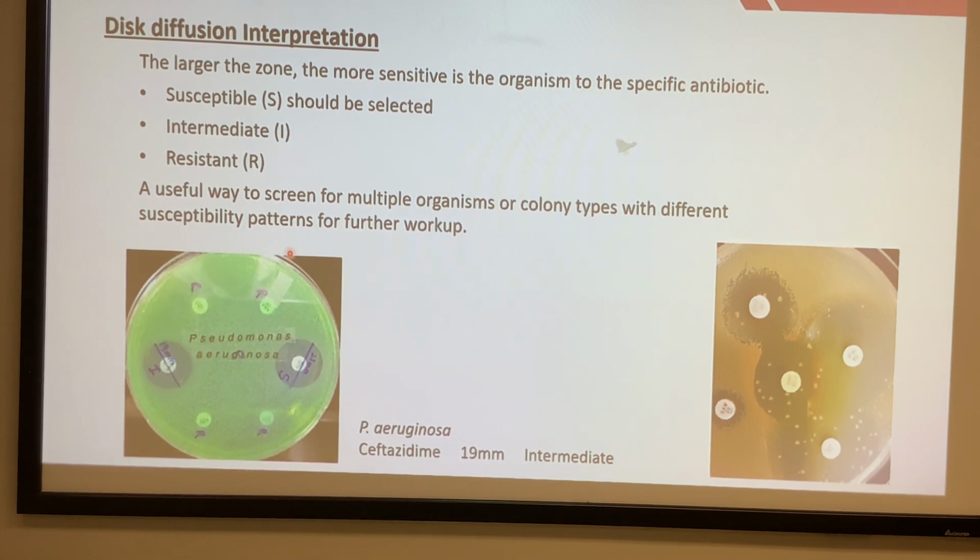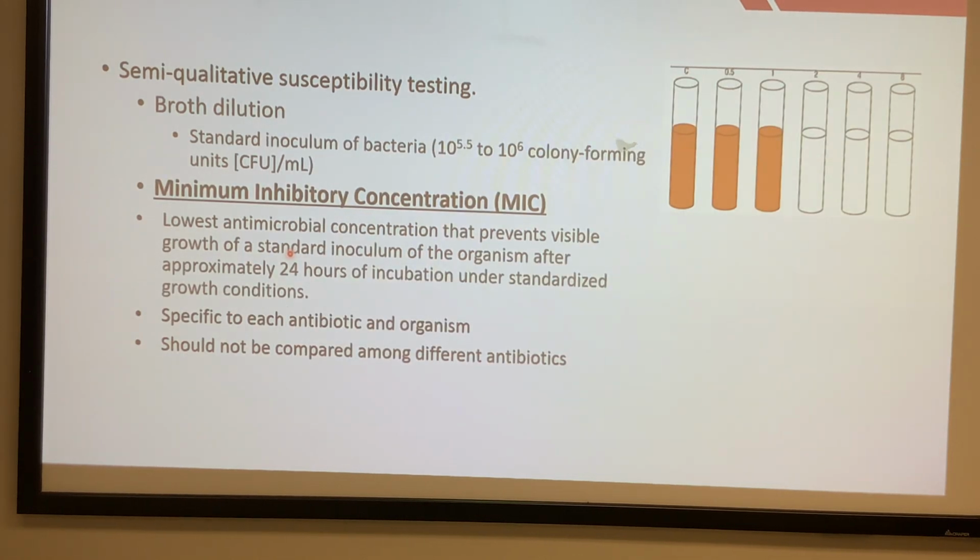Isolate more. Anyway, I do give you an example of intermediate, meaning following this zone, you cannot really use it. It's in between susceptible and resistant. So based on the drug and organism, they do have different cutoffs or breakpoints for these interpretations.